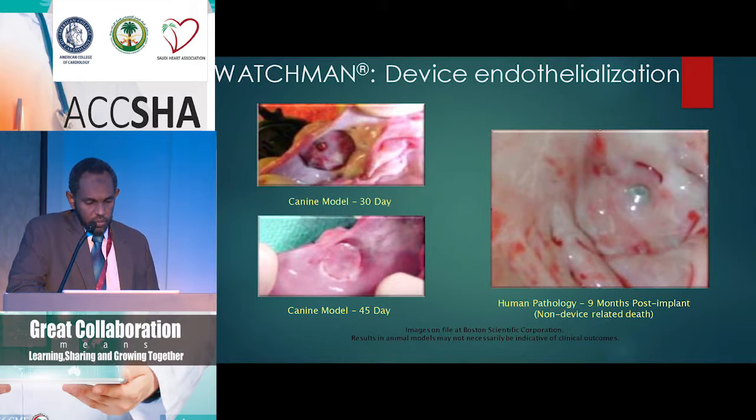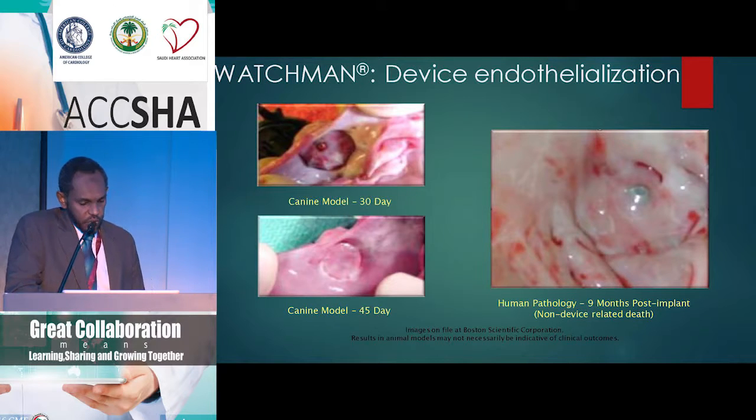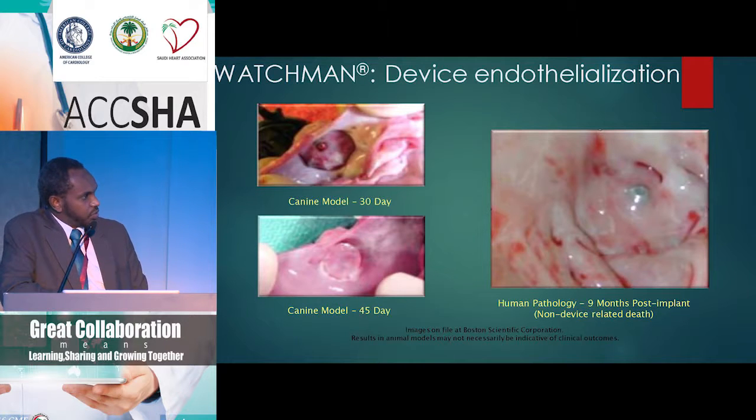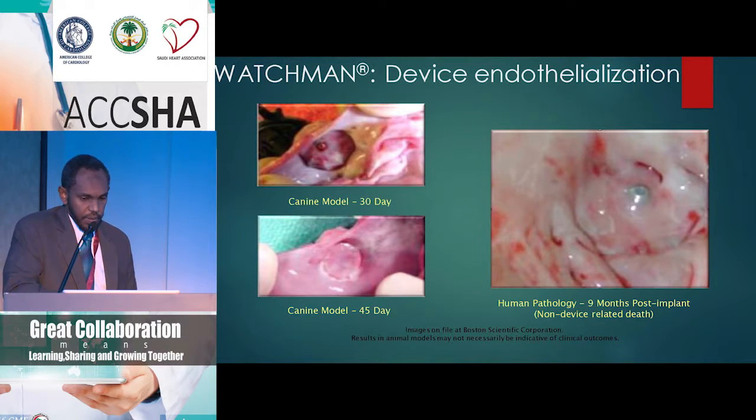This is some of the autopsy findings. The first 2 on the left are canine models at 30 days showing endothelialization, and complete endothelialization by 45 days of the device. This is a human pathology where a patient died for some other reason, and this was 9 months post-device implantation. You can see it's nicely covered and endothelialized.